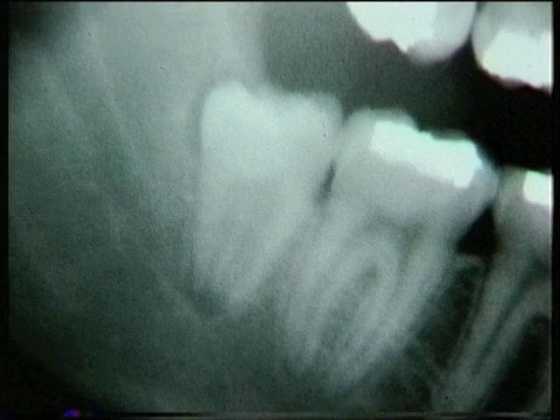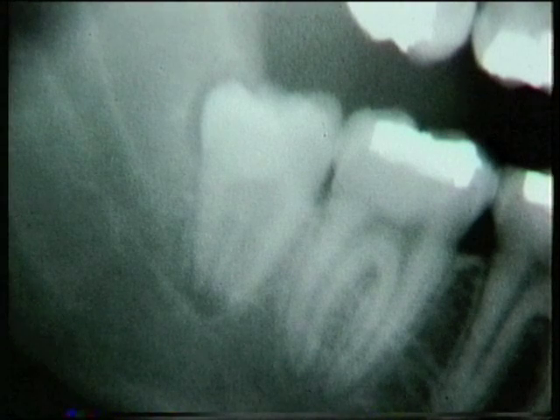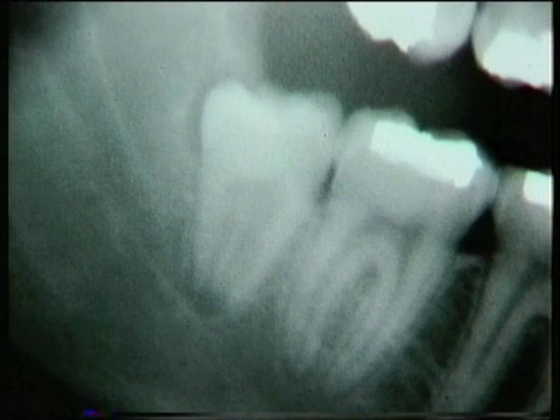We've already established that this tooth has not started to develop roots, so size and shape is pretty irrelevant here. This one had two apparently fused roots, which are of average length and conical in shape. They are not going to present much difficulty in removal.